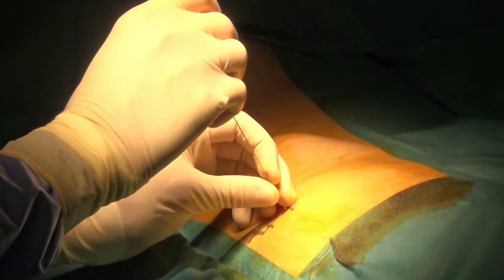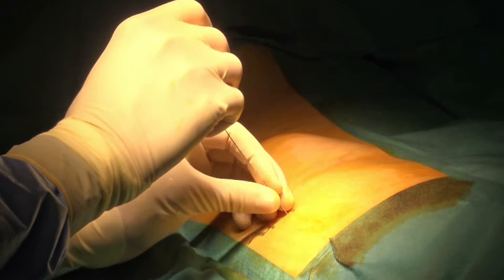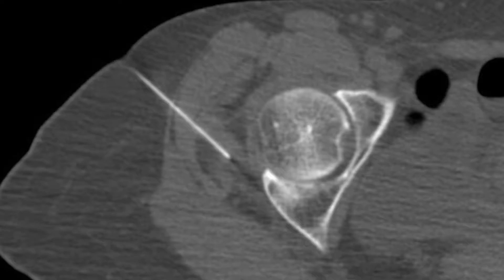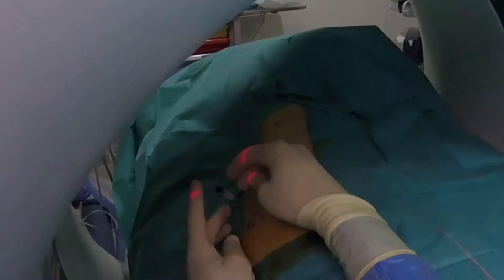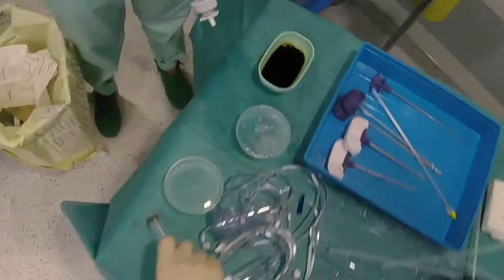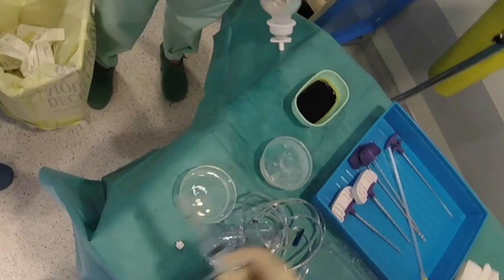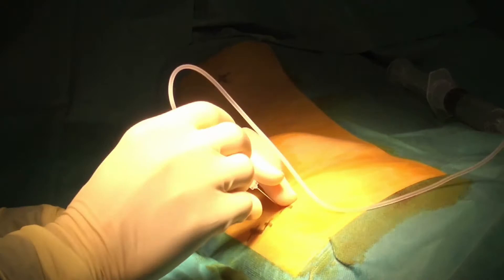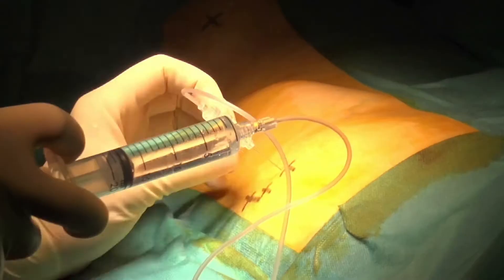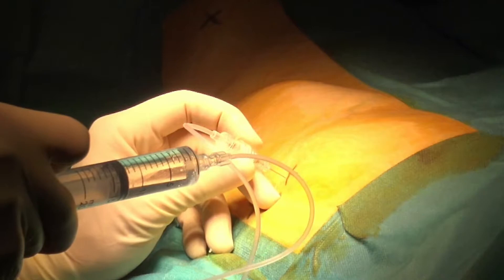The procedure will be performed with the Osteocool device under general anesthesia with combined CT fluoroscopic guidance. The first step is to check whether the sciatic nerve, located just behind the tumor, can be effectively protected using hydrodissection. A 22-gauge spinal needle is inserted just behind the posterior cortex of the acetabulum and carefully advanced with intermittent CT controls. The needle tip has to be advanced just posterior to the acetabulum, and once it has reached the area of the sciatic nerve, hydrodissection can be performed.